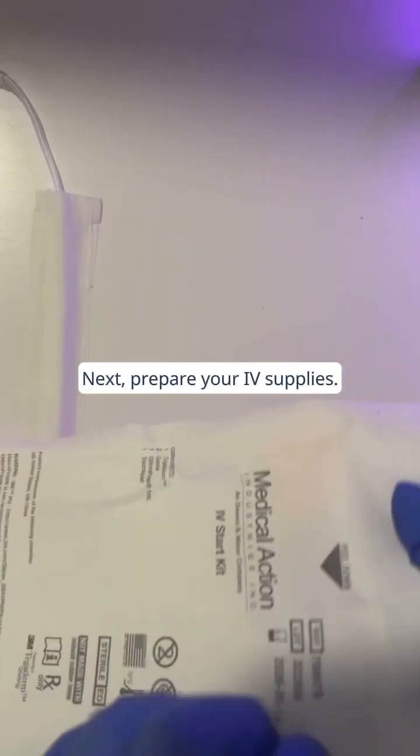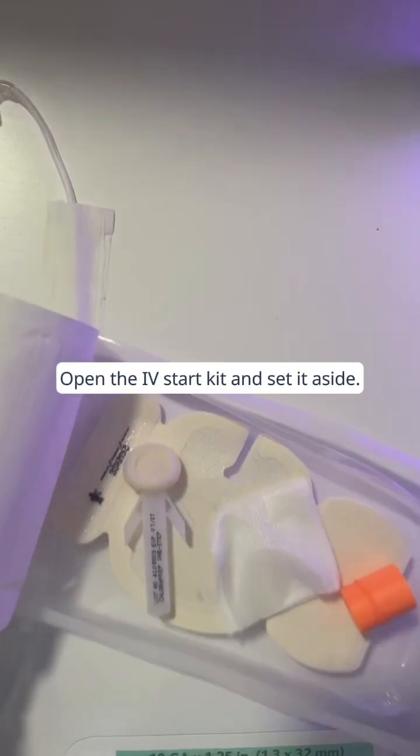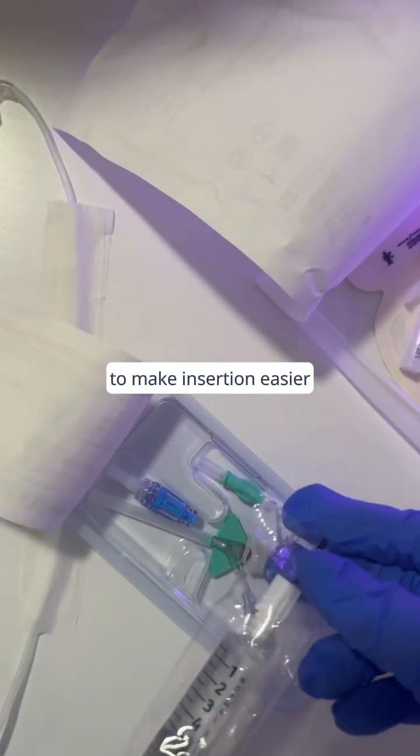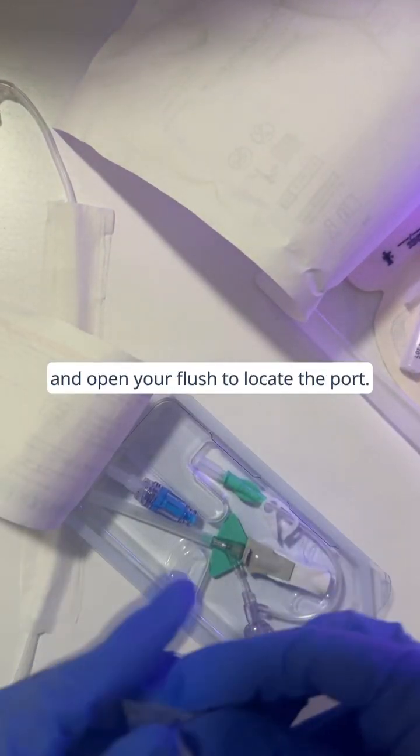Next, prepare your IV supplies. Open the IV start kit and set it aside. Loosen the IV catheter slightly to make insertion easier, and open your flush to locate the port.